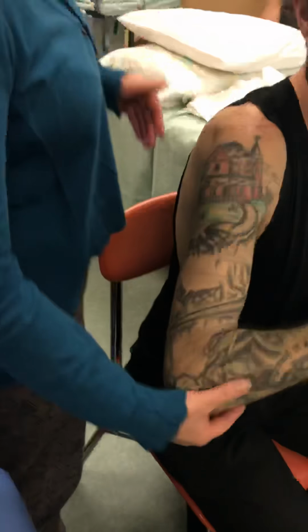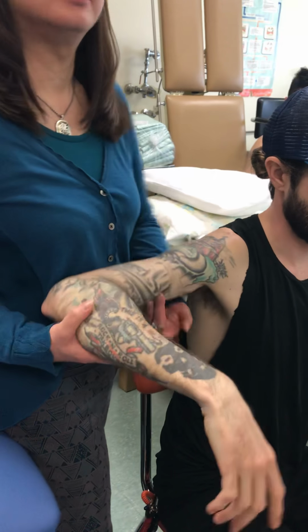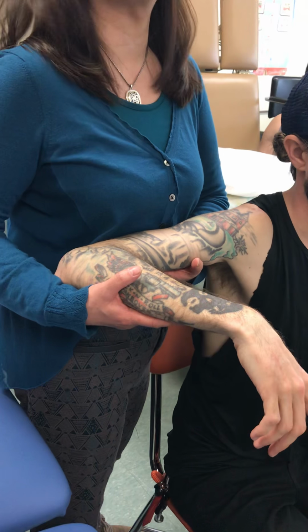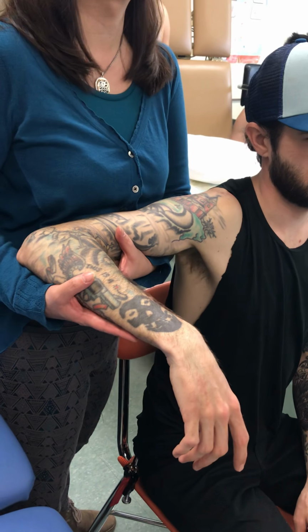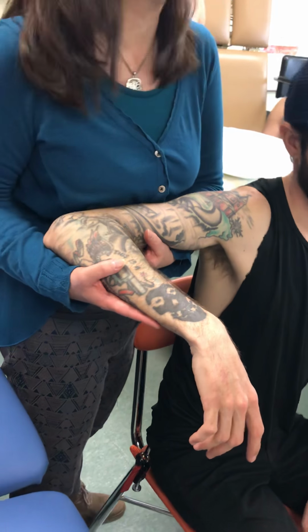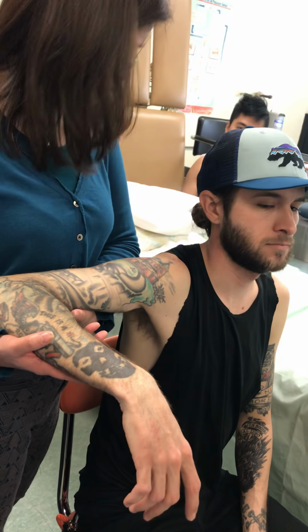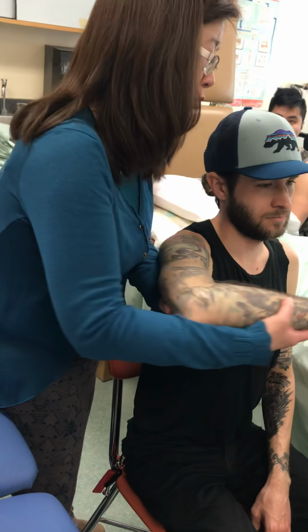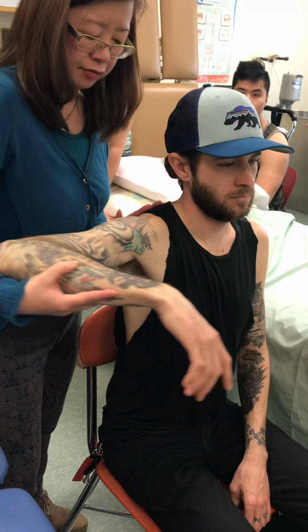All right, before you guys go on break, if I'm doing this passively, drop it as best as you can, I'm going to support it, and I like to be in the back of him, because it's just easier for me. And if I stand right here, am I violating his personal space more? People don't like that. As long as I have access to his facial expressions, it's okay. I want you to keep your back as straight as possible, and try not to turn your trunk. I'm going to bring it across as far as I can go, and then bring it back as far as I can go.